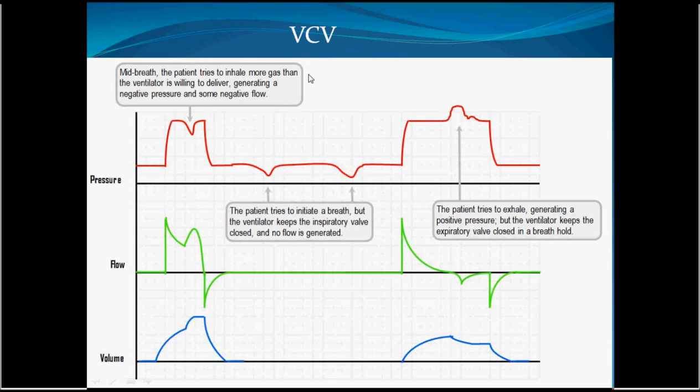Another important characteristic in the case of volume controlled ventilation is that the ventilator itself is preset, with a preset flow and a preset tidal volume. Whenever it is stimulated, the demand valve will open, and the ventilator does not respond to the patient otherwise. If the patient takes another inspiration during the flow, the ventilator will not respond. If the patient starts to cough, the ventilator will not respond. And if the triggering value is below the preset value, the ventilator will not respond.